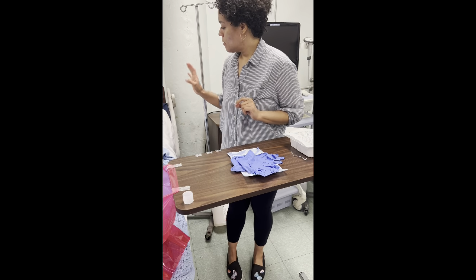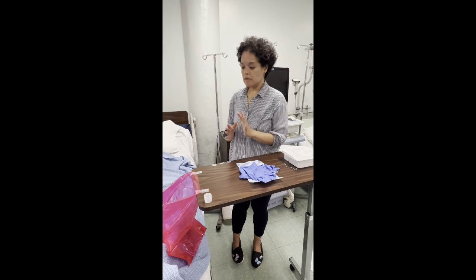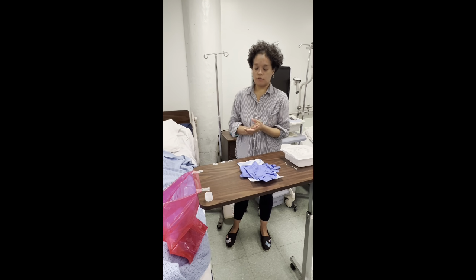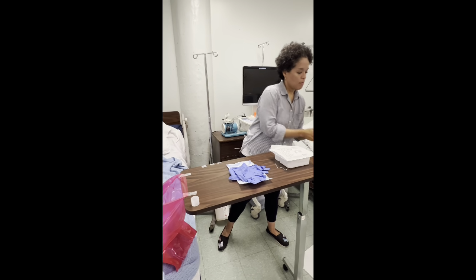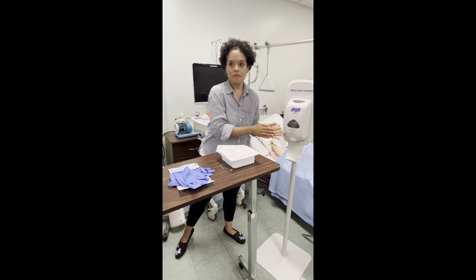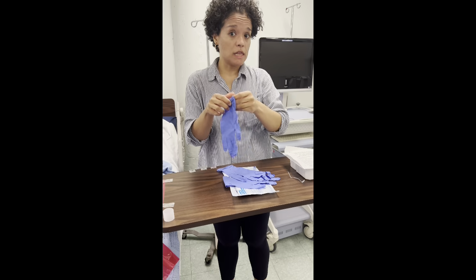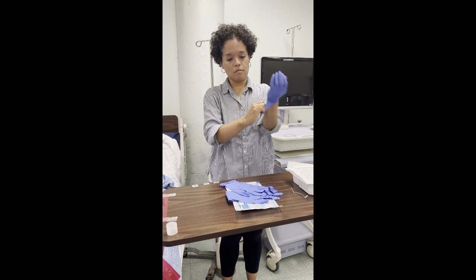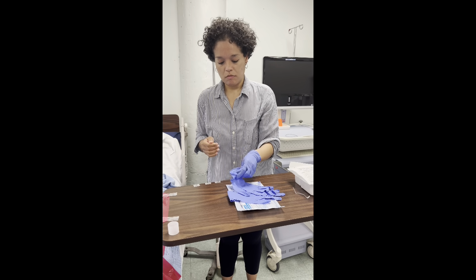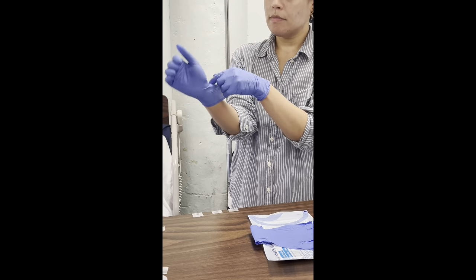And so we're going to go over to the patient. This is where we're going to remove the dry dressing. Before you do that, make sure your hands are clean. And then, once your hands are clean, put on your non-sterile clean gloves. All right.